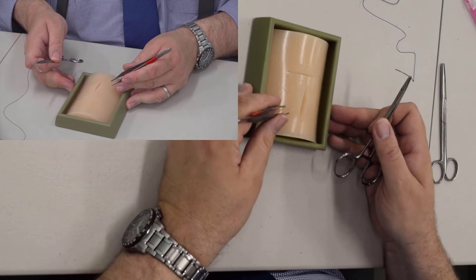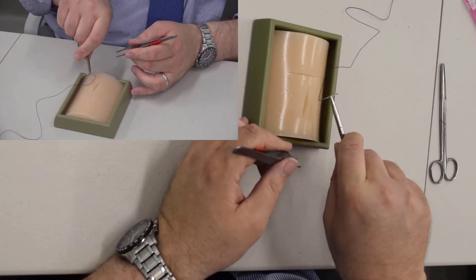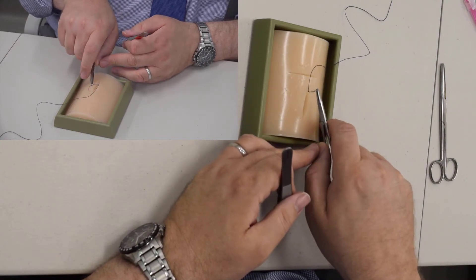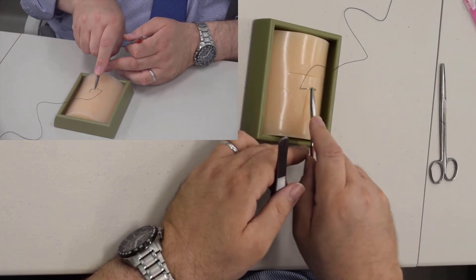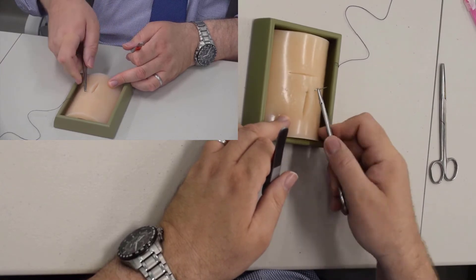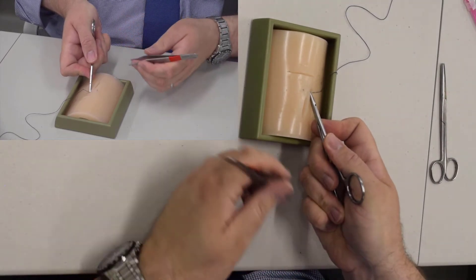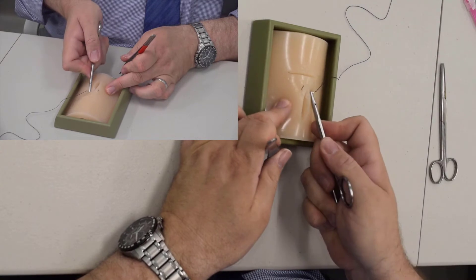When we take our first stitch, you're going to rotate your wrist back and the needle is going to come about an eighth of an inch from the edge of the skin, perpendicular to the skin. Once you're there, rotate it. If you need a little more leverage, pop it open, grab it, push it through.